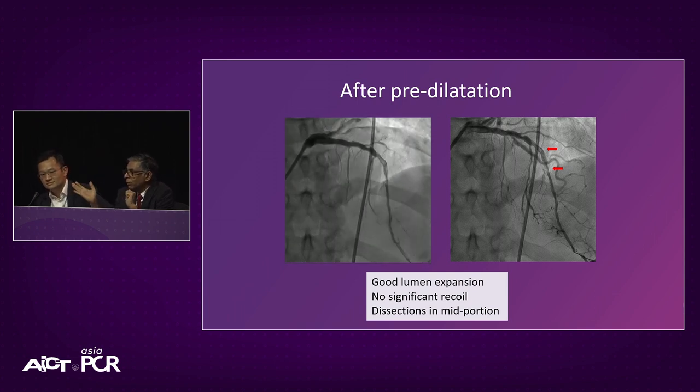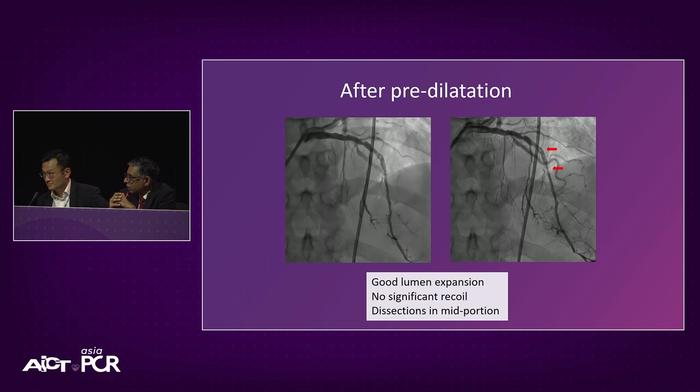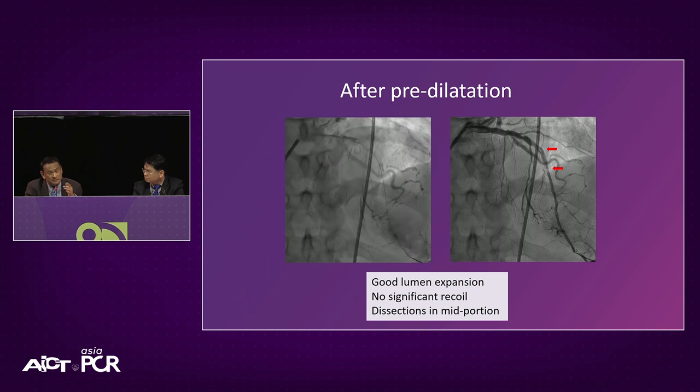And so I agree with what Rosli said: do a more prolonged inflation if you're worried about the dissection. Leave a balloon up for 4 minutes, nothing happens, patients do fine. That's the old-fashioned POBA style, and then try to DCB in this particular case. If you want to assess not just flow, then I think physiological testing may be useful, but not an IVUS.